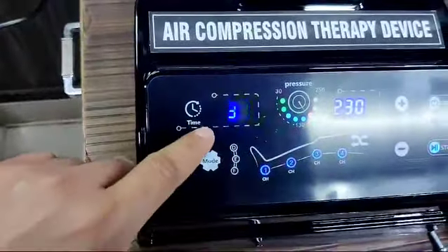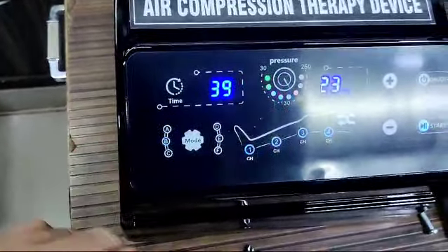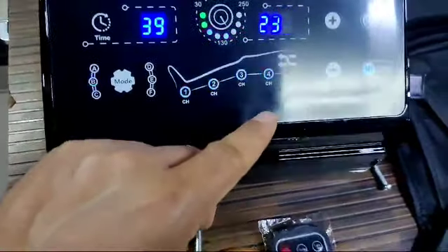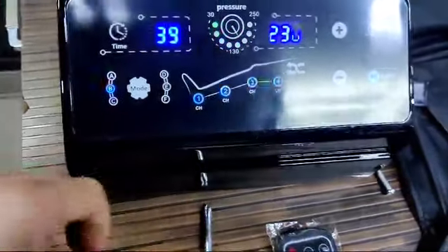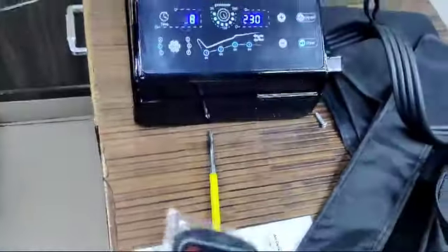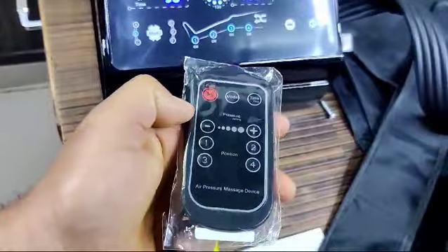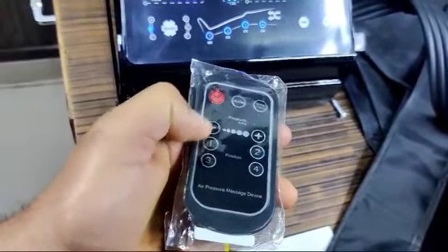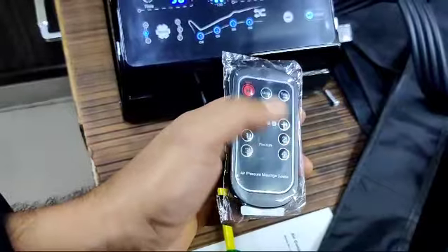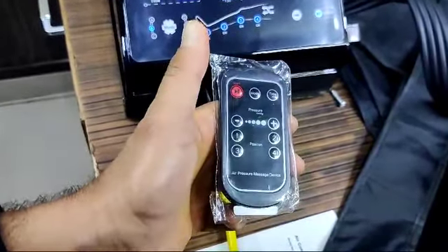You can see the timer is decreasing, and I have it set to Mode B. You can also operate the machine from a distance using the remote control — you can increase or decrease the pressure, switch chambers one, two, three, or four on or off, and start, stop, or set the time.